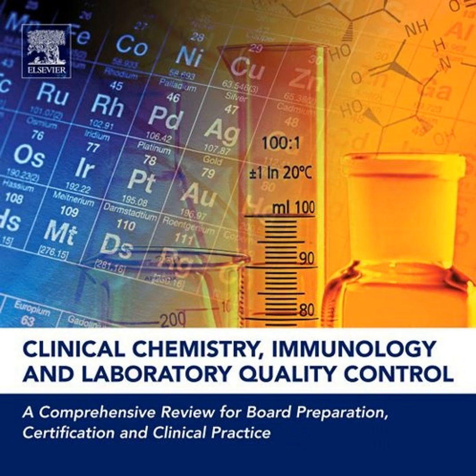Let's start with the most dangerous one, the prozone effect. Absolutely. And this isn't just a lab error. This is misdiagnosing a potentially life-threatening condition. The prozone, or hook effect, is a pitfall specific to sandwich assays. So what happens? If a patient sample has an extremely high concentration of the analyte, a classic example is a molar pregnancy with just sky-high HCG levels, that excessive analyte saturates both the capture and the detector antibodies at the same time. And that saturation prevents the sandwich from actually forming.